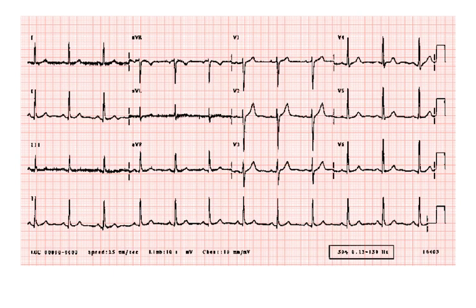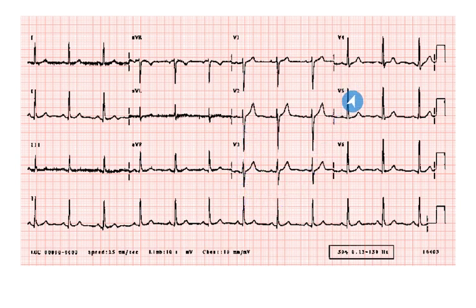Similarly, look at the S wave. It's tall in V1 and V2, then in V3 it becomes smaller, V4 more small, and in V5 and V6 it becomes very small.